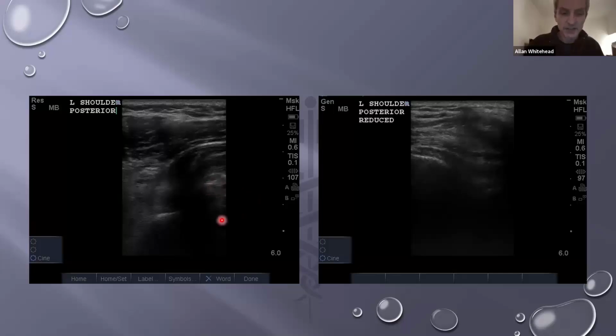So in this patient who actually is dislocated, it's an anterior dislocation, which, as we know, is far, far, far more common than a posterior dislocation. Probably, as I said, I've done about 30 cases with ultrasound, and then probably another 50 or 60 or 70 with X-rays before that. And I've only seen a couple of posterior dislocations. So 1 or 2 in 100, that's how frequent they are in my experience, very rare. So anterior dislocation, way more common.